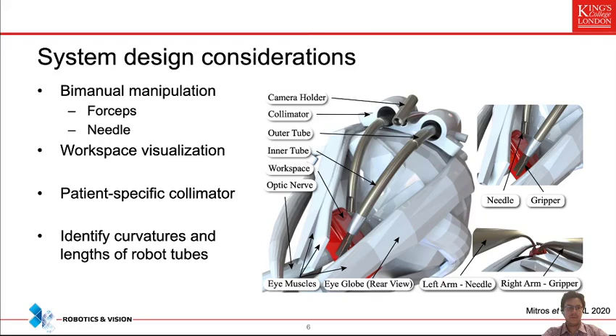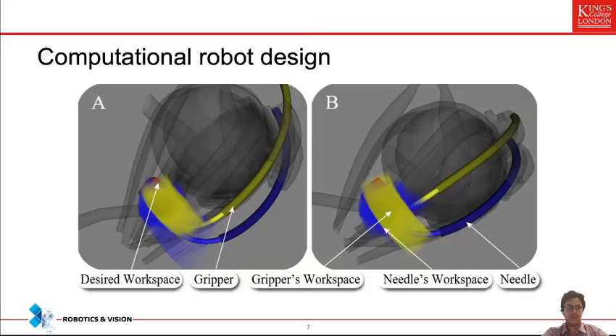To create the navigation section, we took patient information from MRI scans, segmented the eye sclera — the white part of the eye — and created a patient-specific collimator comprising two cannulas and an open channel through which the camera passes. This collimator can be sutured on the eye sclera, something clinicians do routinely in procedures like scleral buckling. Through this construct, the concentric tube robot tubes pass to reach the workspace indicated in red. We then used our computational robot design toolbox to iterate over different curvatures and tube lengths, maximizing how well the two arms reach the red workspace while performing the bimanual task.